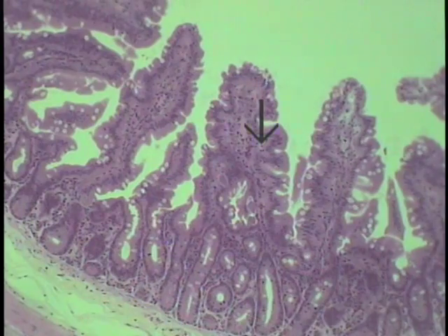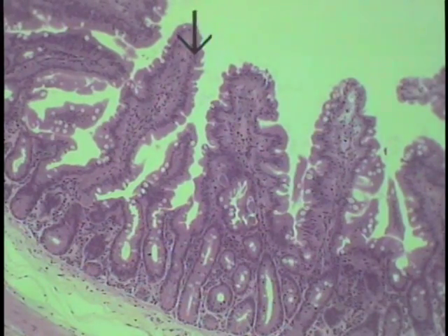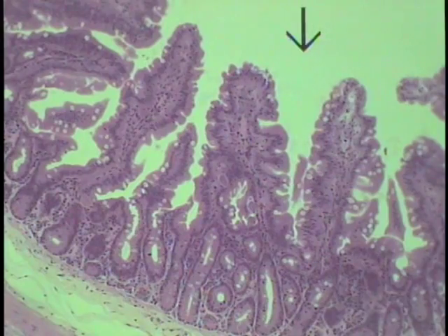This is a section through the jejunum, so the intestine a little bit further down the gastrointestinal tract. Like the remainder of the intestinal tract, it shows villi, though perhaps a little bit smaller. These finger-like extensions extend out into the intestinal lumen where the arrow now illustrates.